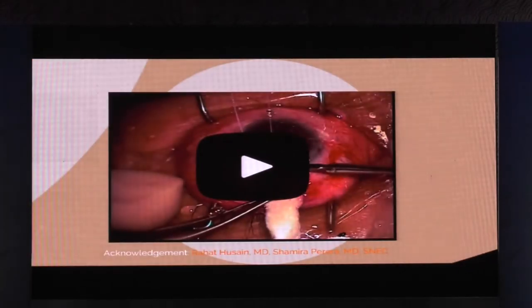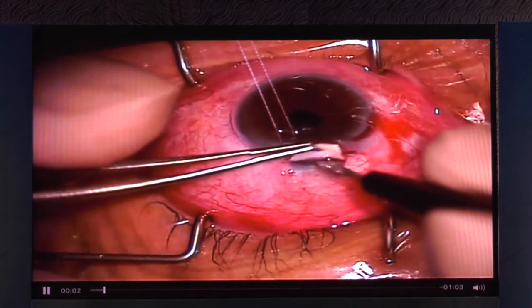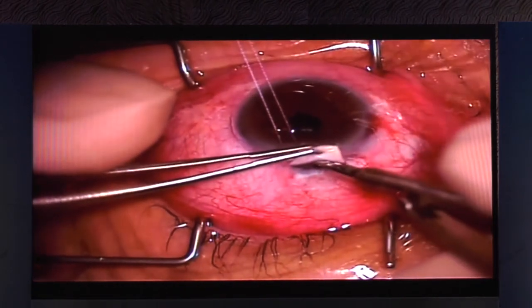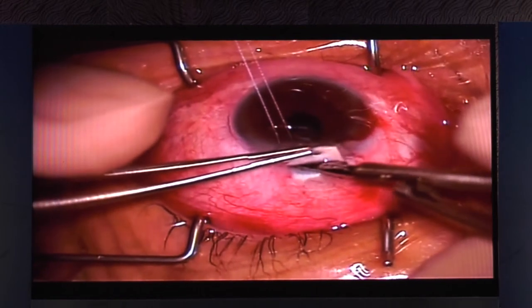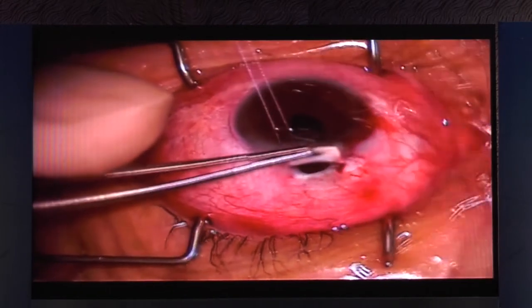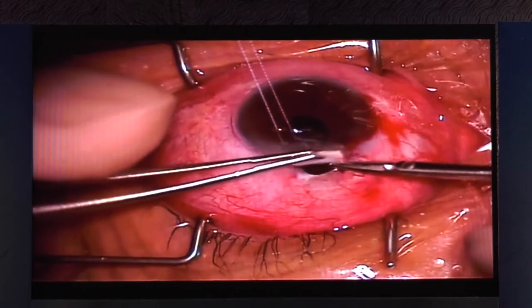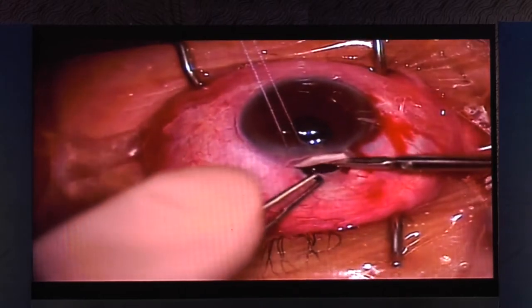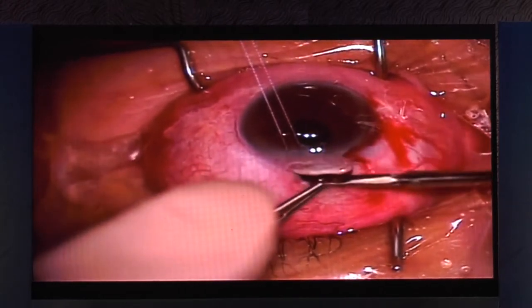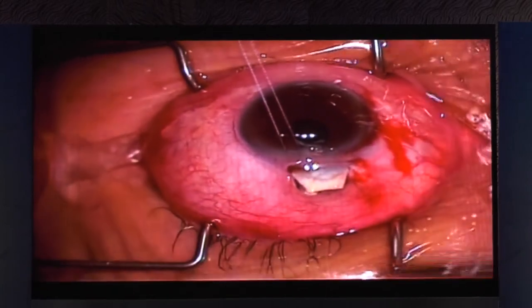So in this case, it's a patient wherein they have done a little too big a sclerostomy. You can see that the first one was okay, right in the blue zone, but he went a bit overzealously and he did a second one posterior to it. So this is actually choroid presenting, which they didn't realize. Then they make a nice sclerostomy without realizing it. And then, unfortunately, a blob presents, and they were not sure whether it's vitreous or viscoelastic. It was vitreous, surprise, surprise, which is why I'm presenting this.